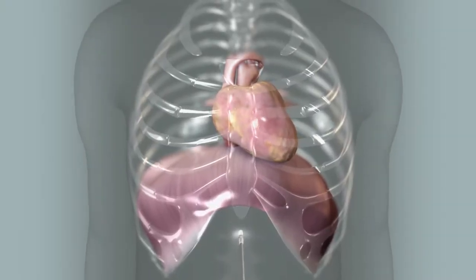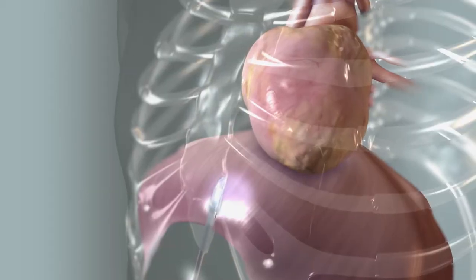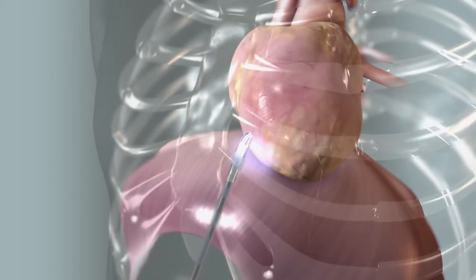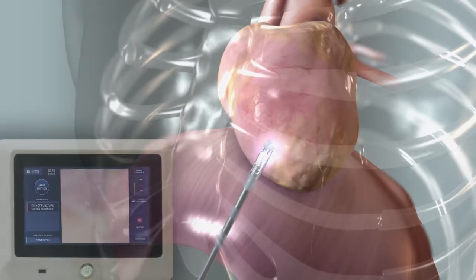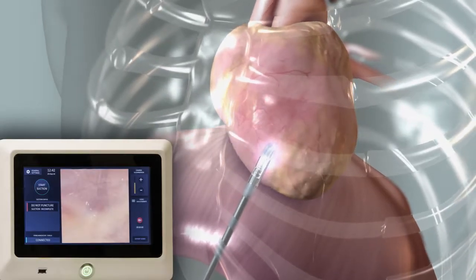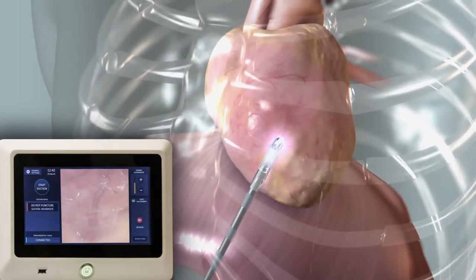Begin the procedure by inserting the device with a subxiphoid incision. Navigate to the heart. Identify the pericardium on the video image.